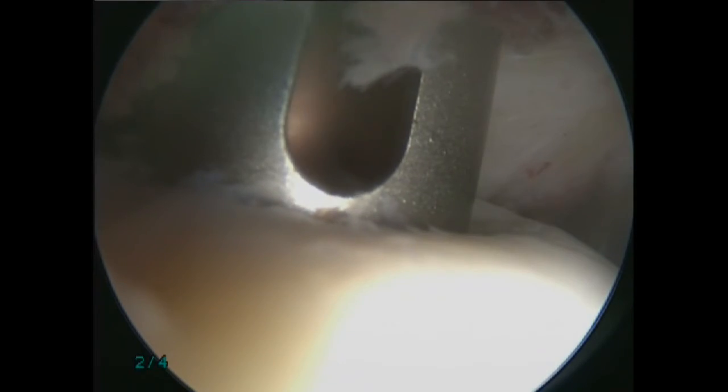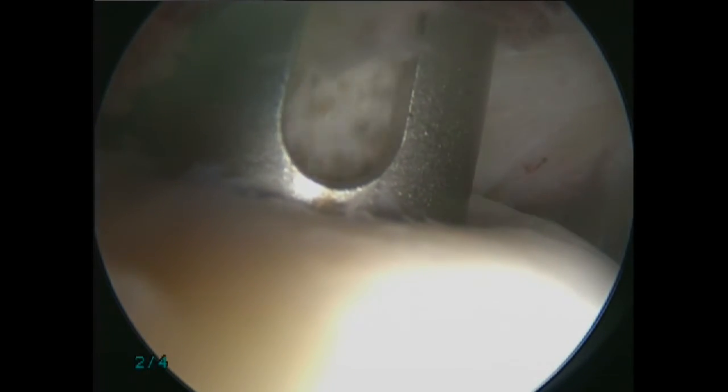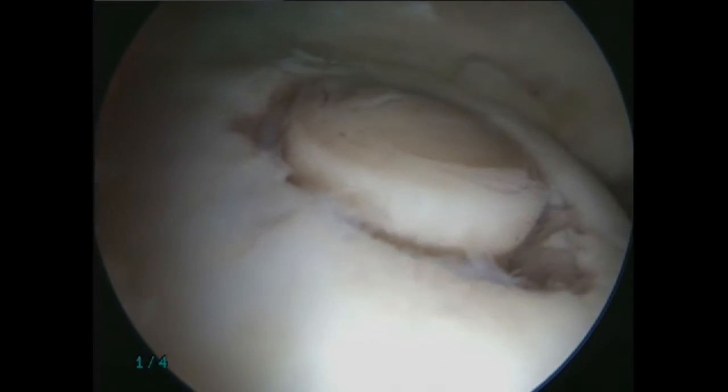A cylindrical osteochondral graft was harvested from the ipsilateral knee joint. The autograft was placed over the region and tamped into position.